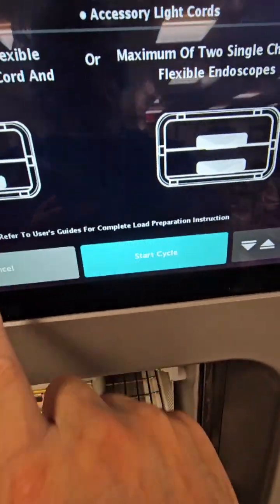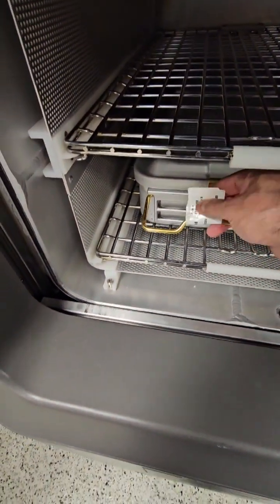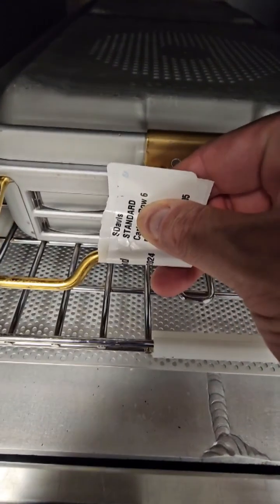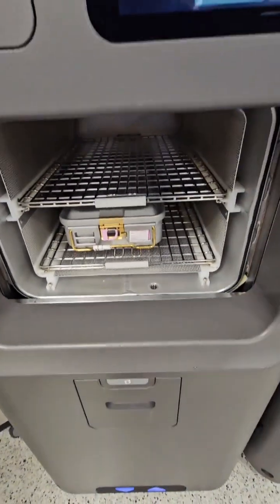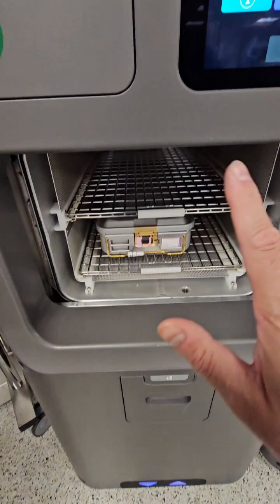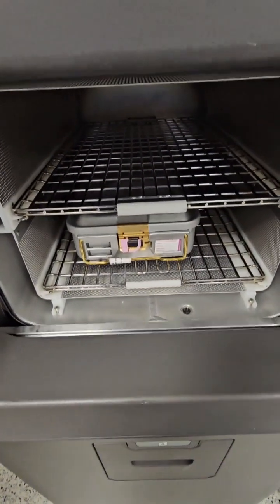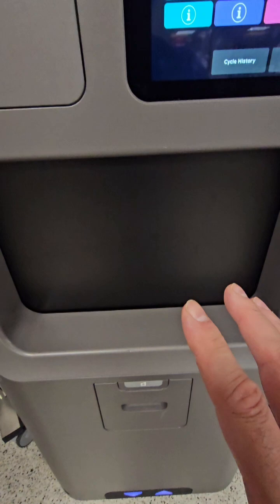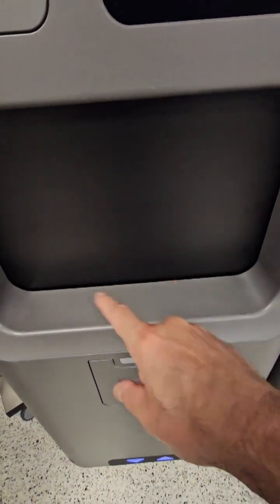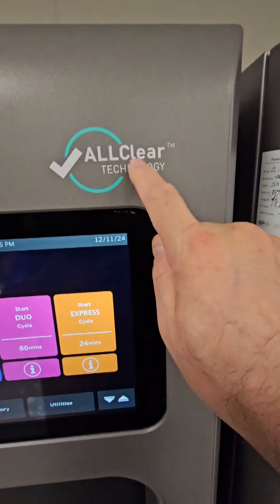Let's talk about the really big issue I see out there when technicians are running this sterilizer — and I'm doing it right now as I'm doing this video: keeping the chamber door open for too long. Right before you're about to put your items in, open your door, place your items in the sterilizer, and close the door immediately. Temperature is a huge factor in the completion and success of a cycle. The longer you keep the door open, the temperature in the chamber is going to drop and it's going to take a lot longer to condition the load — even with the all-clear technology.